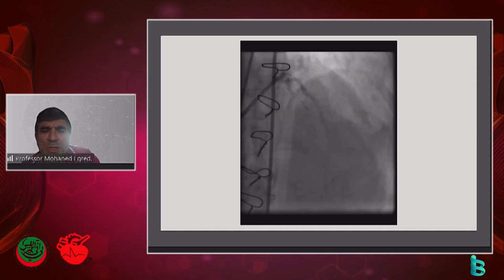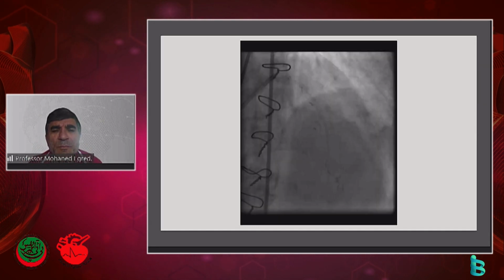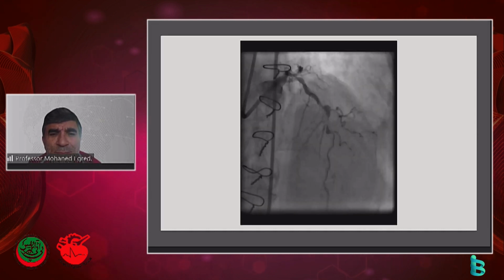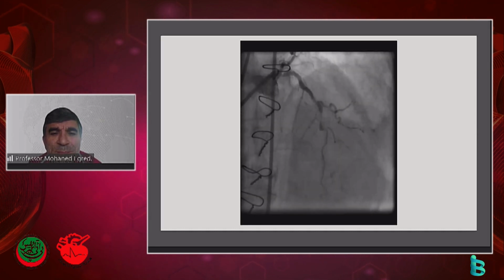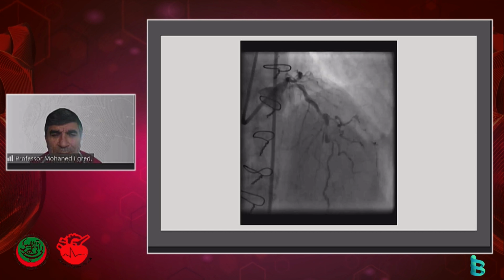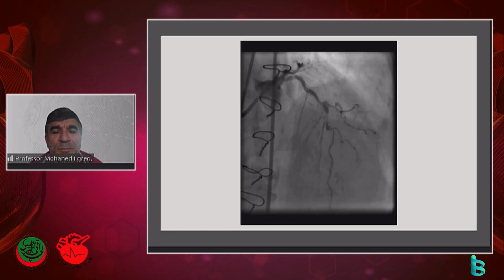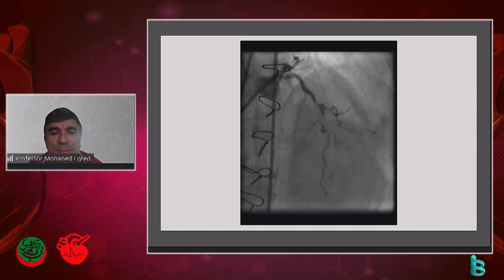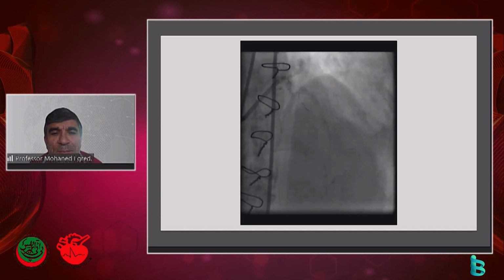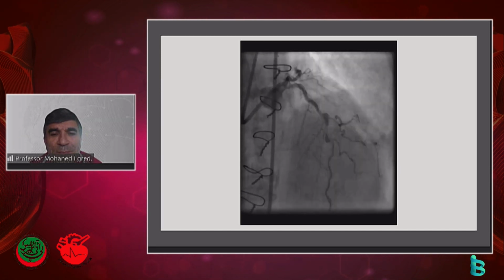Because you can see they have the calcium, which is typical after CABG. You see over here that the biggest challenge is going to be at the point where there is that jump in the vessel also. And because you have your stitch placed over here, this is going to be the biggest challenge, to put your stent over here and make sure it goes up. And then there's another lesion after that also which has a bend. So there are plenty of bends going around.